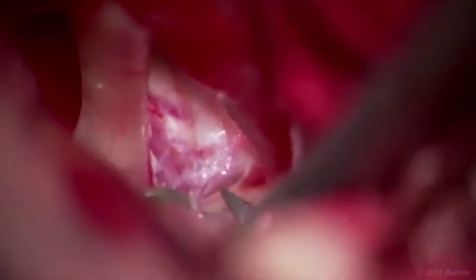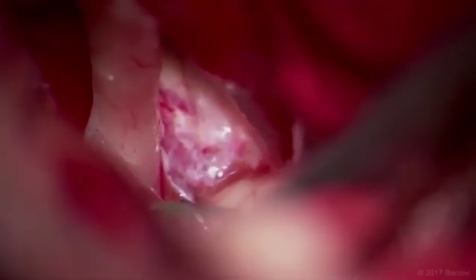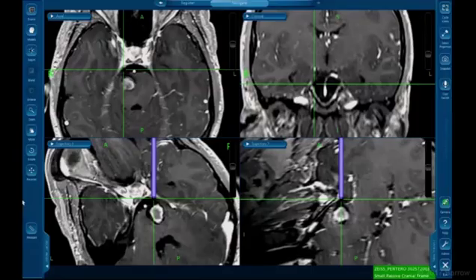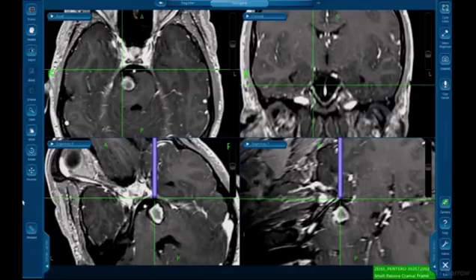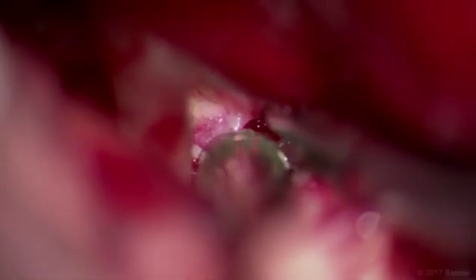This maneuver allows the surgeon to arrive at the brainstem lateral to the third nerve at a point that is safe to enter midbrain for removal of this cavernous malformation. The neuronavigation is used to choose an optimal point of entry. The point of entry should be the point that minimizes transgression of the brainstem. In this case, it so happens that the optimal point of entry is at the perioculomotor safe entry zone.